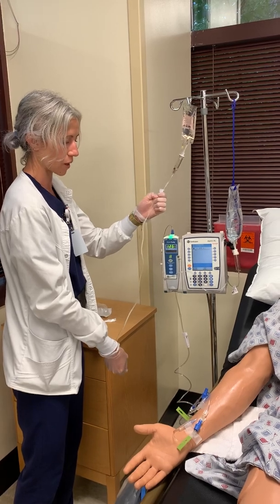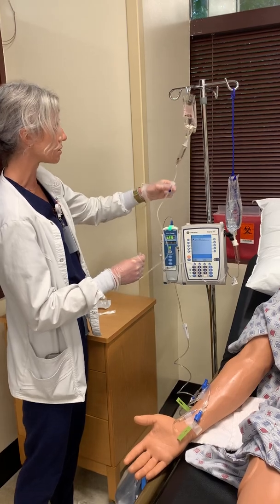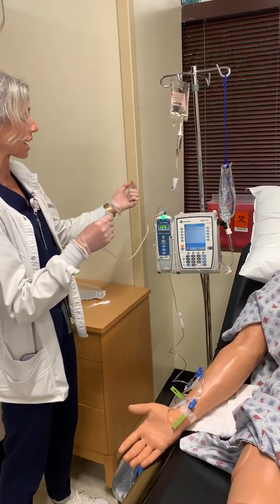It's gonna be nice and quick, okay? So you wanna do that nice and quick. All right, so I see that I don't have any air in my line. I've got fluid coming through the tubing, so mine is set up, okay?